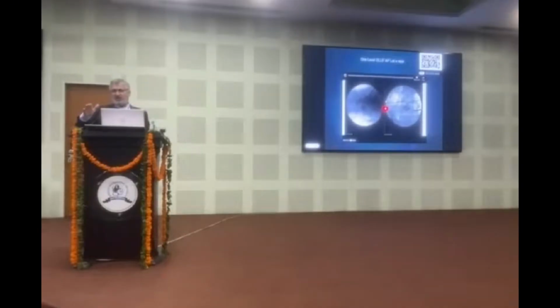Do you remember the talk? If you are uncomfortable with that, you can use the scope, you see where you are going. But this allows you to cut another hour of surgery because you don't have to put the scope in. I know that Dr. Varun started with that, and I did a few dozen of that, but then I got so comfortable like Dr. Varun that I quit using the scope, and I only relied on neuromonitoring. Now, for us surgeons, we are very visual people. It's hard for us to rely on numbers; we want to see things, we want to see the nerve.